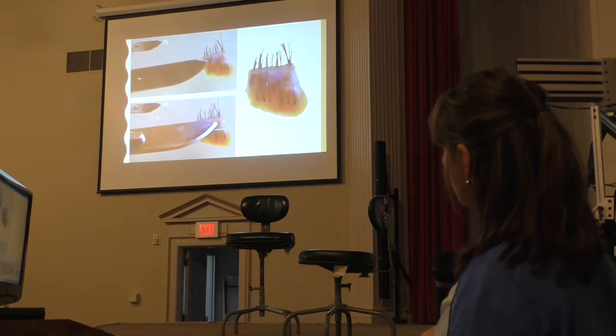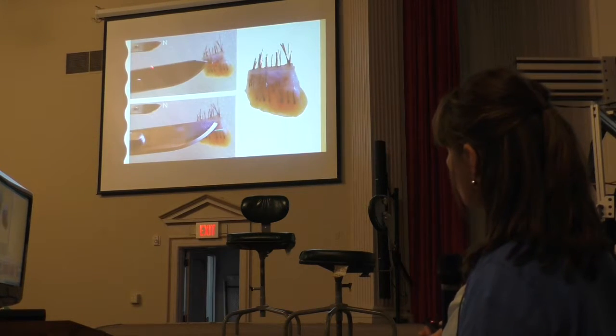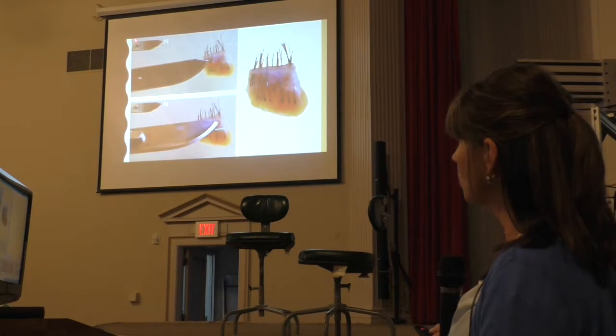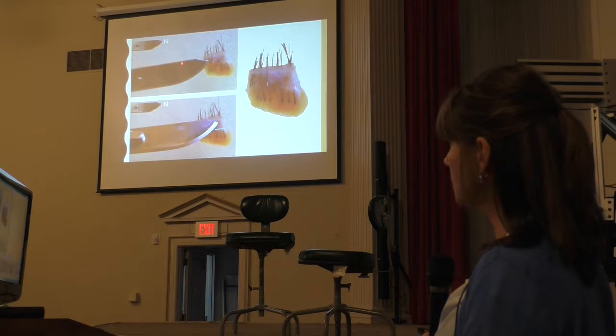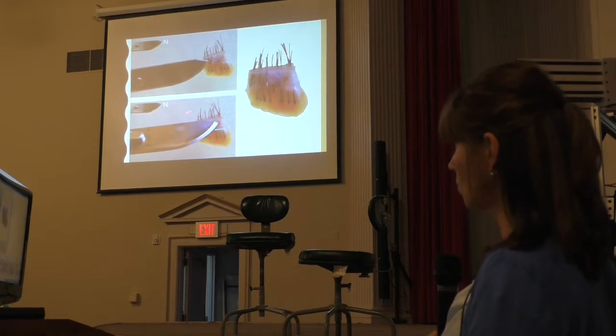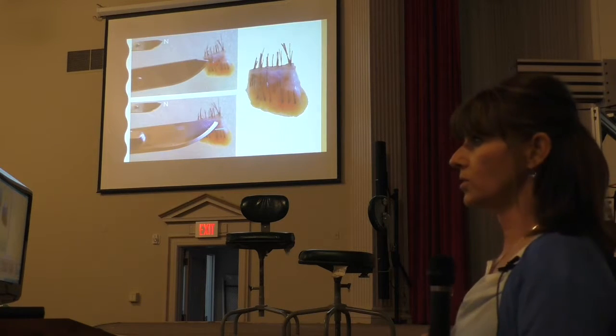So neutral position, see the difference? When I say neutral position, it means my blade was parallel to the hair shaft. In this case it wasn't, it transected here. In this case it was overcorrected or tilted the opposite. You see that, right?